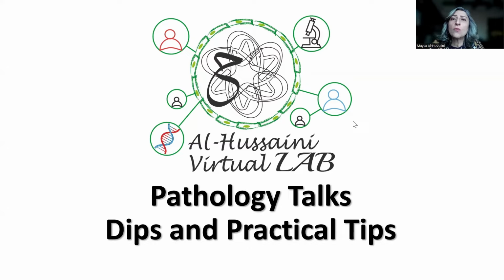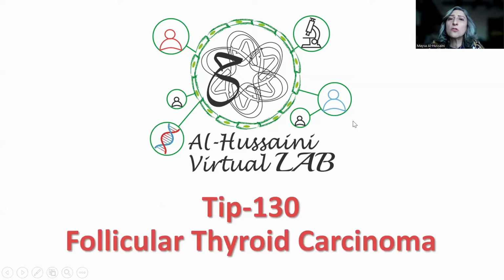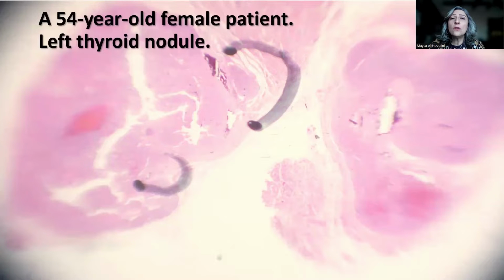What I'm going to be sharing with you today is a very nice example of follicular thyroid carcinoma. The case is courtesy of Dr. Anwar Al-Masri. So this is a case of a 54-year-old female patient who was noticed to have a left thyroid nodule which was excised. And this is the very low power magnification, actually the scanning power magnification.